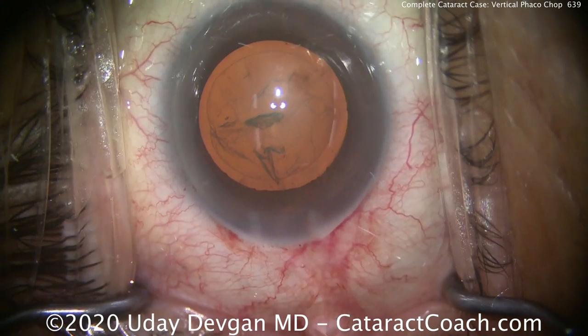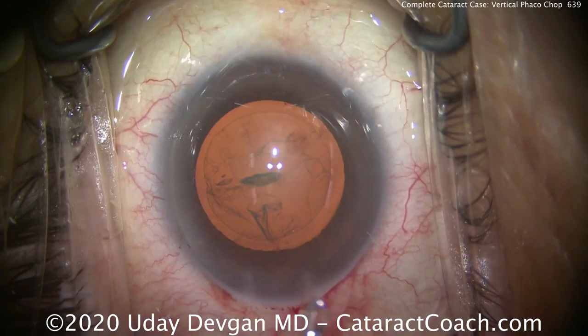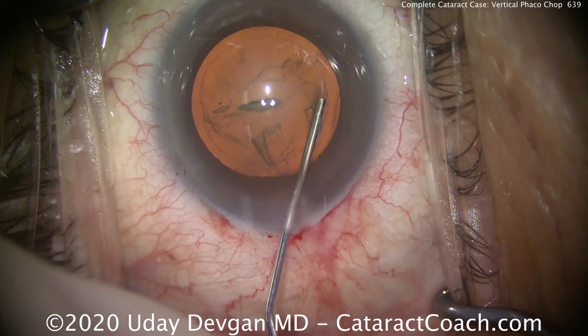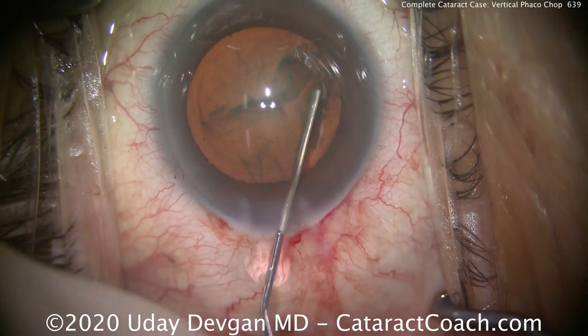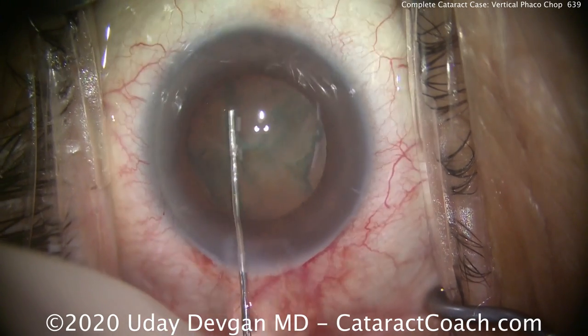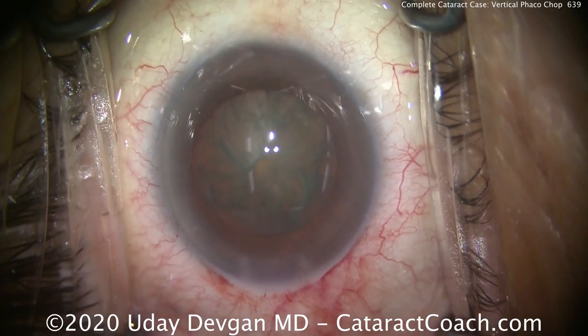And there's the finished rhexis, looking good. Now for a vertical chop technique, you definitely want good hydrodissection, but we're going to leave the nucleus in the bag — don't prolapse it out of the bag. So there's a little bit of a fluid wave. We can get another wave. Tap the center of our nucleus. There we go. Let's see if the lens rotates — and it rotates. That's all it takes.